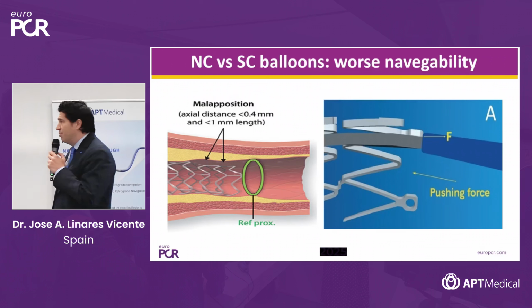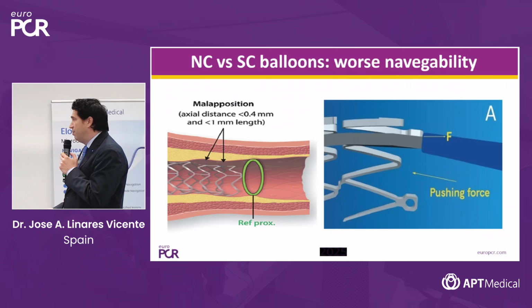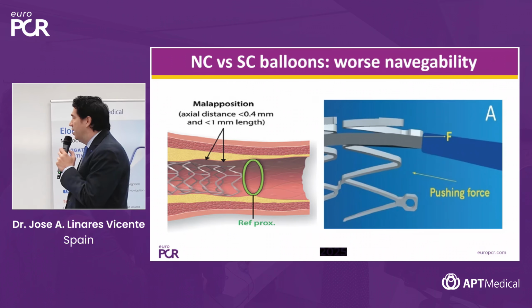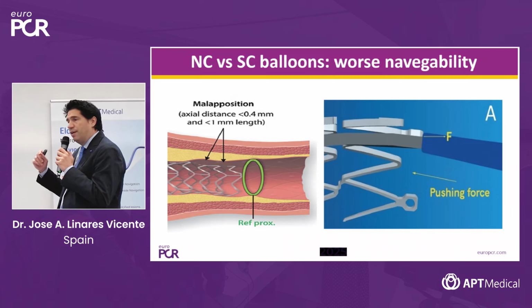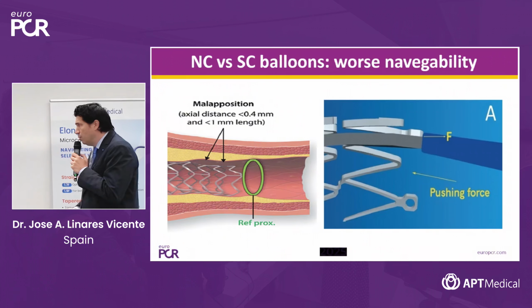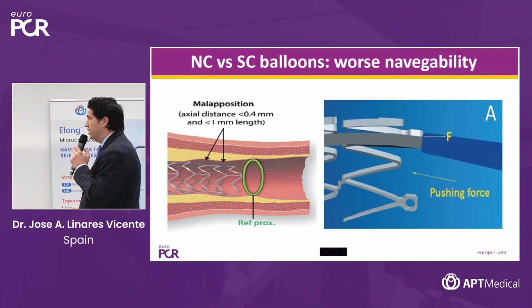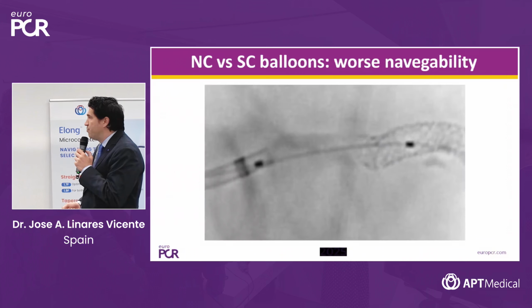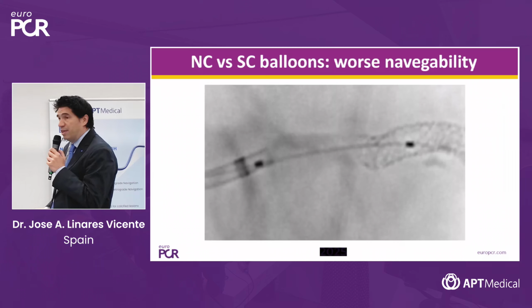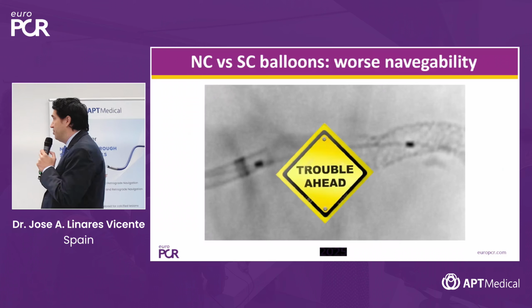Particularly in cases of stent malapposition, we can have a big problem with tapered tip balloons, as the tip of the balloon can collide against the stent struts, blocking the advance of the device into the stent when we need to post-dilate the stent. If we push harder in these cases, we can cause a stent mechanical complication and big trouble ahead.